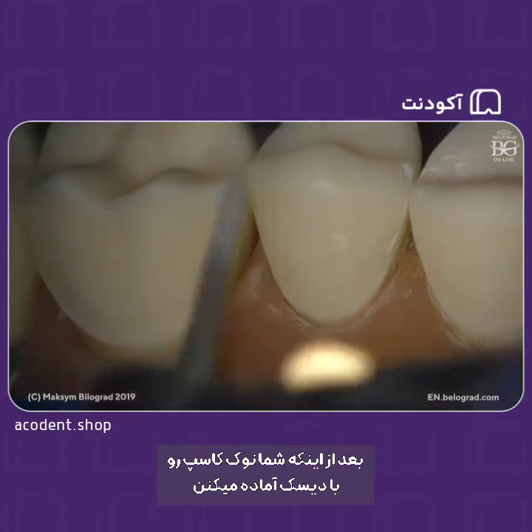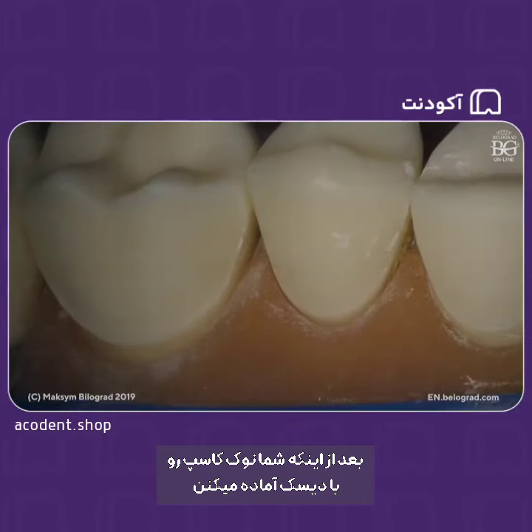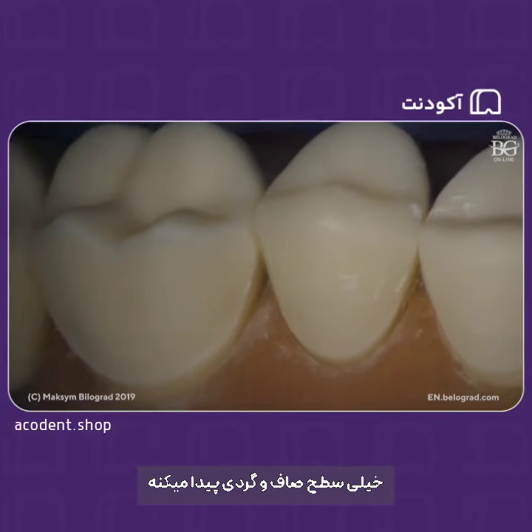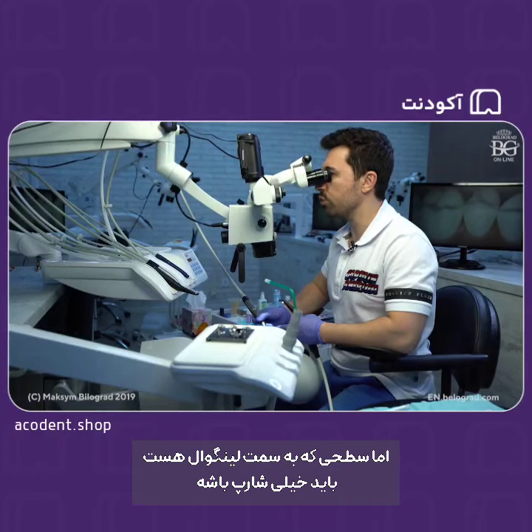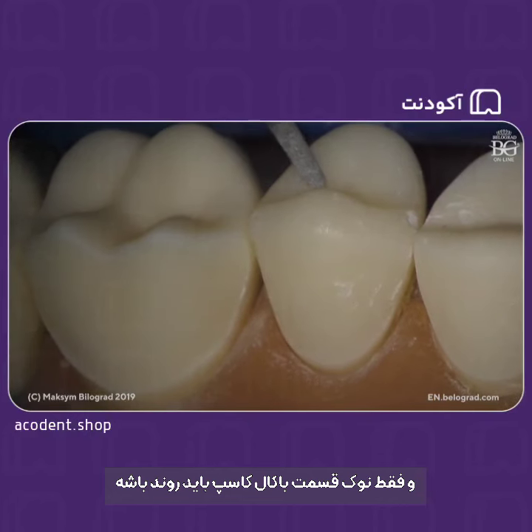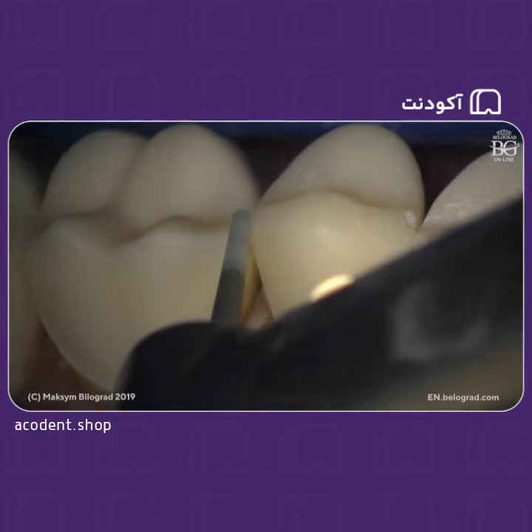And also once you touch the tip of the cusp with the disc, it's too soft now, it's too rounded, this part, I mean, this one. This has to be really sharp. This has to be rounded, this has to be sharp. So let's just refine.